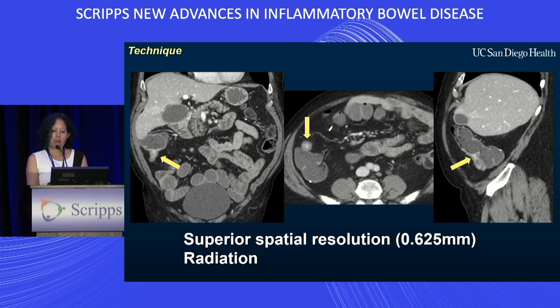But this is kind of the last time I'm going to speak specifically about CT, because honestly, the best utilization of CT in patients with inflammatory bowel disease from the radiologist's perspective is the patient who comes in with an acute issue, coming in through the ER, getting an acute hospitalization, in which case you don't need to do an enterography.